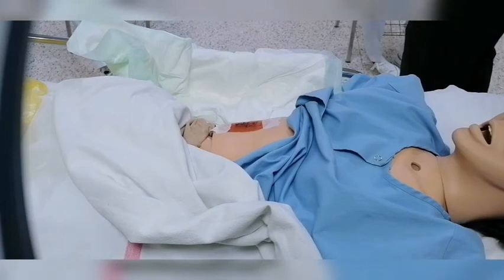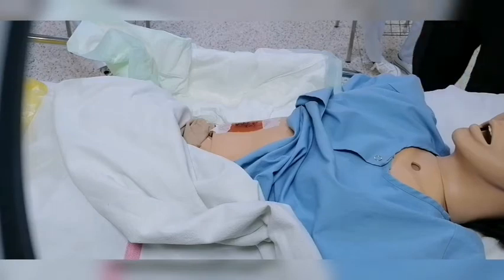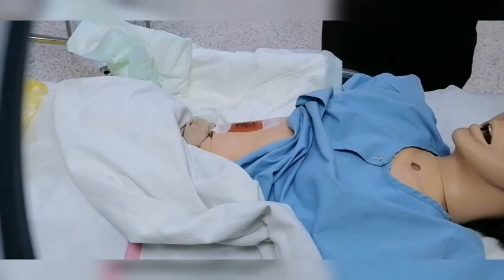So what's the benefit of wearing the sterile gloves in this case? We can sometimes use the non-touch technique, for a simple wound, without wearing the gloves. But in this case, we have to arrange our equipment. We have to touch the forceps from just the end, which is away from the cotton side that we are using. We will use it during that.